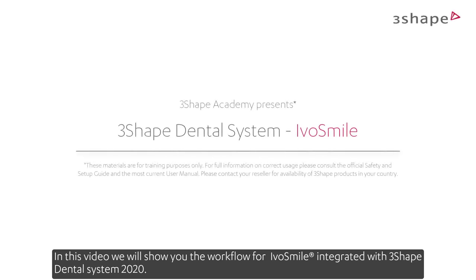In this video, we'll show you the workflow for IvoSmile integrated with 3Shape Dental System 2020.